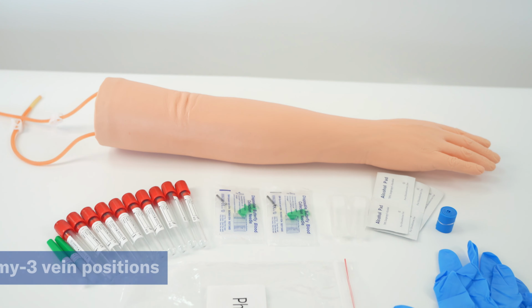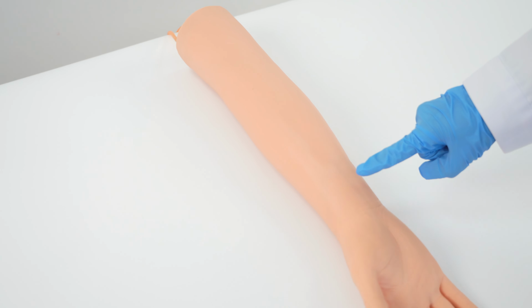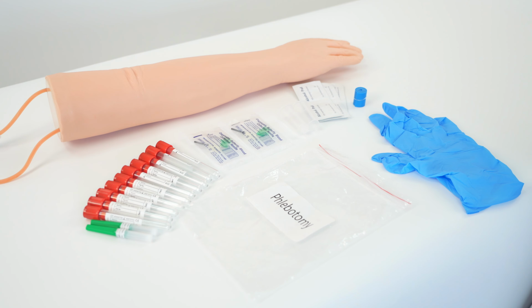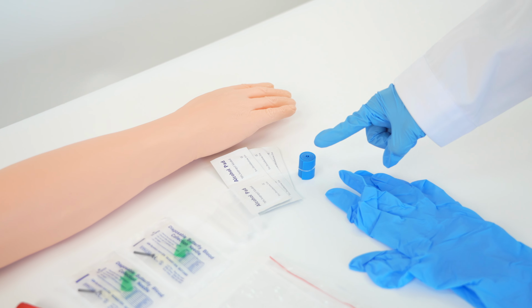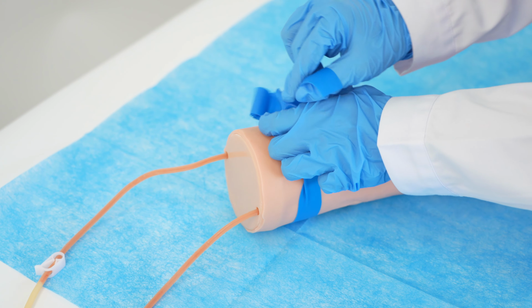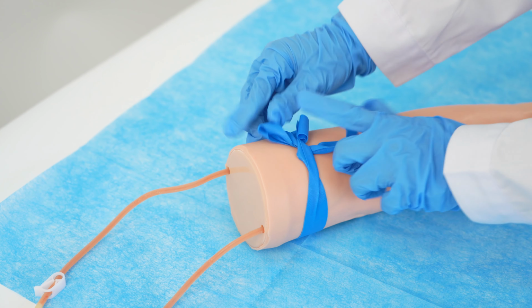Next, we'll practice phlebotomy, focusing on 3 vein positions: cephalic vein, median cubital vein, metacarpal vein. On the table, you can see the tools for this scenario: phlebotomy bags, gloves, tourniquets, alcohol pads. Adjust the arm by positioning it flat on the work surface for easier access to the veins. You may need to adjust the clamping settings on the arm to make each vein more prominent.